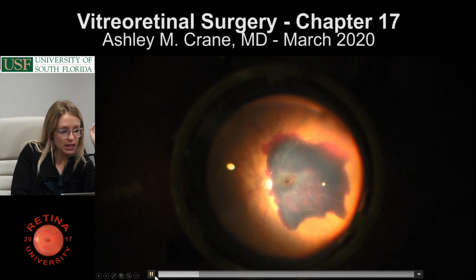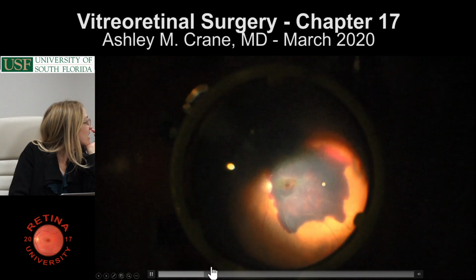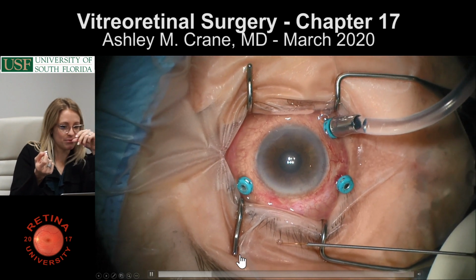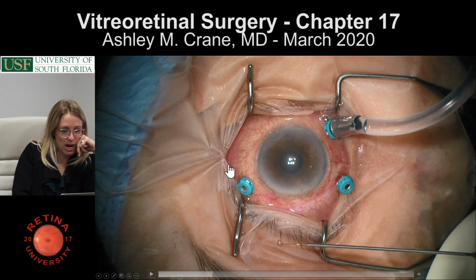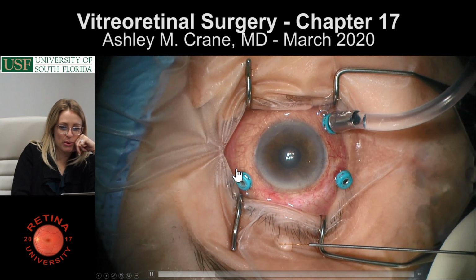So let's see if I can get it started again. Okay, so in a minute I'm going to prime the TPA. The TPA is delivered on a very small cannula. Let's see if I can advance it. I'm hesitant to click this many times because, there we go. You can see that I'm priming that TPA there. And maybe that's primed quite enough.